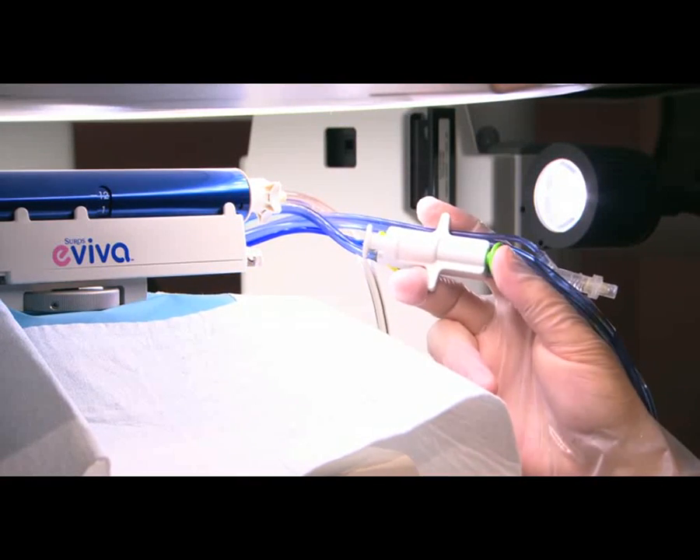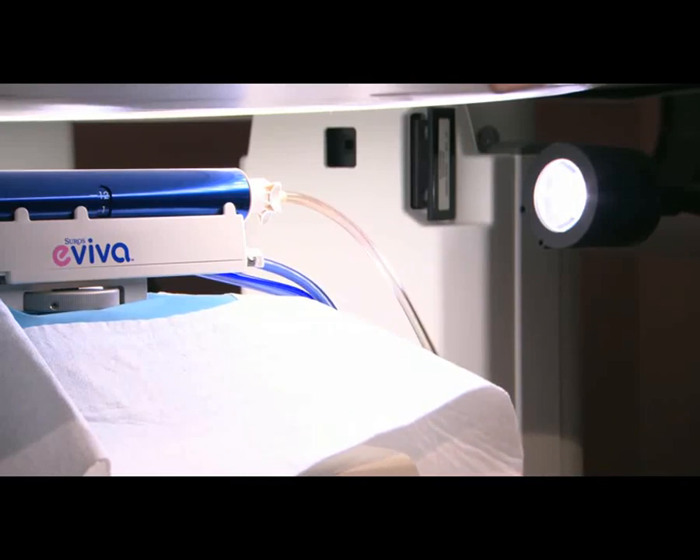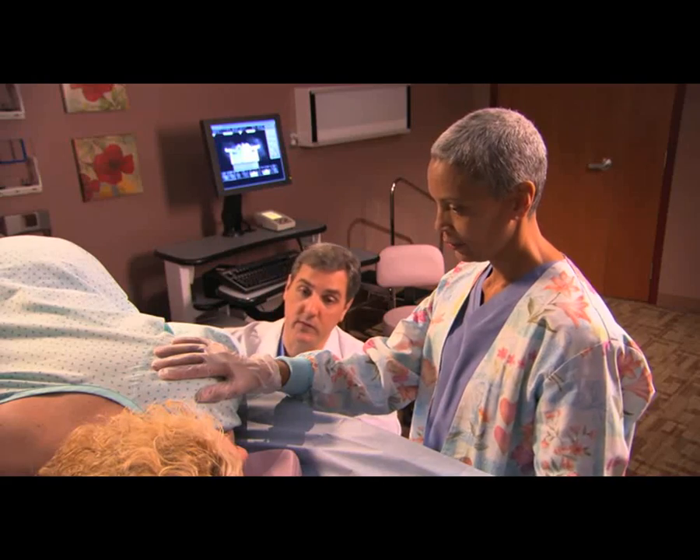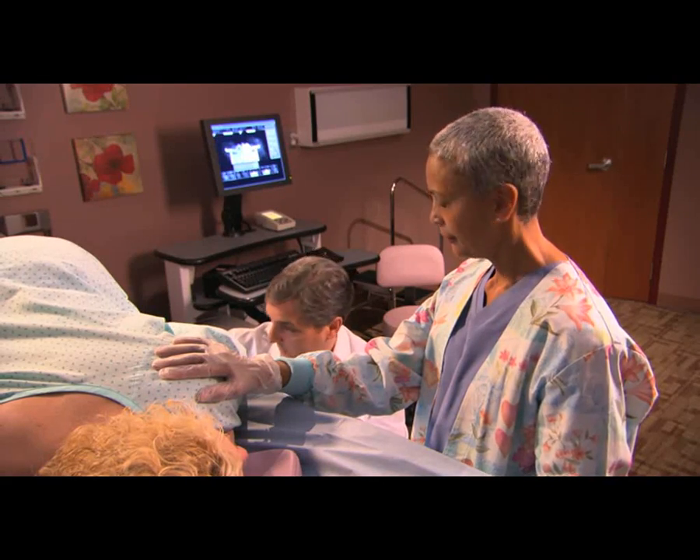Because when the instrument is triggered, you'll hear a noise and you may feel some pressure. This advances the tip of the needle into your tissue to the exact point where they want to take a sample.